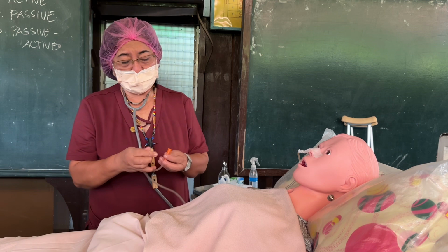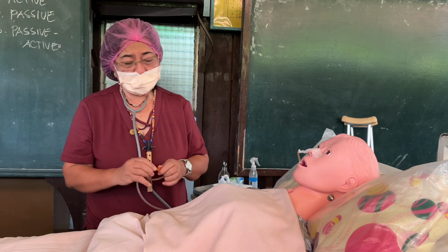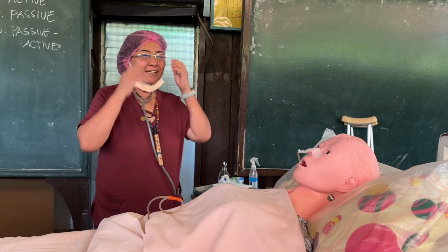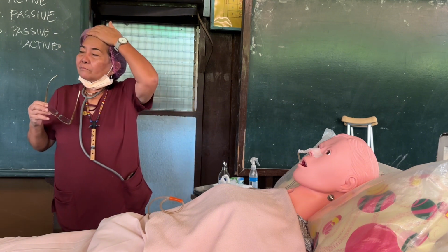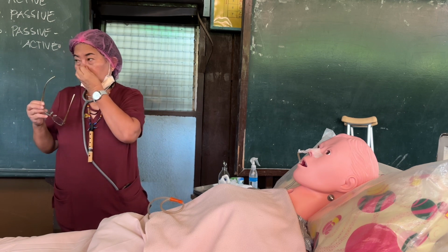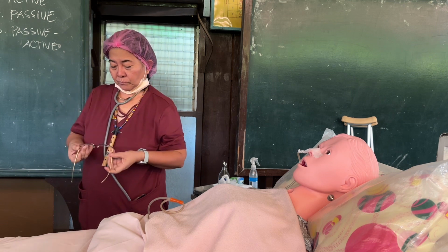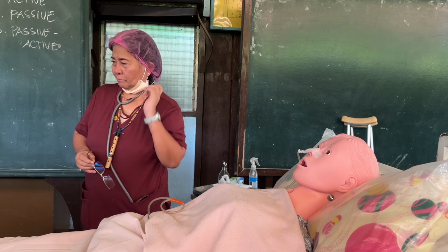Next procedure. Okay, documentation. How many cc are you aspirating? Document the character of the output, color and smell, vital signs, and reaction of the patient during the procedure, who did the procedure, and then indicate that we did it by time and stage.